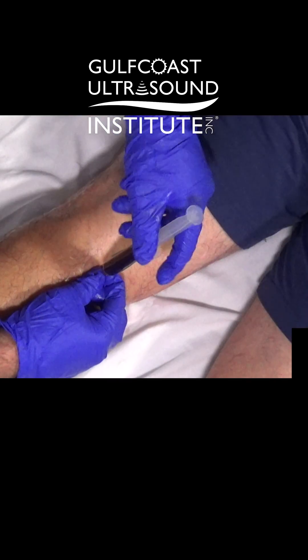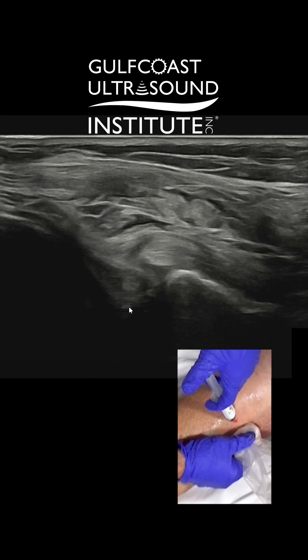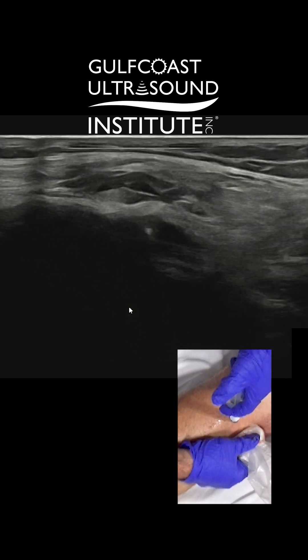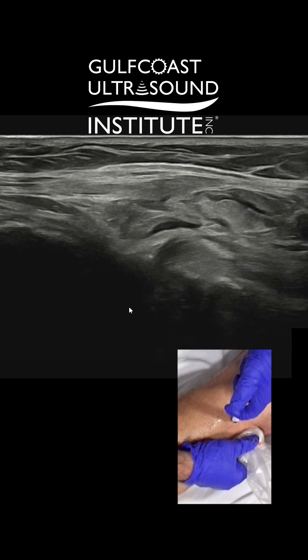So I'm just going to put maybe an ml or two in here. The PRP — so how much do we have? There's 10 ml. So I'm going to put about an ml in here.